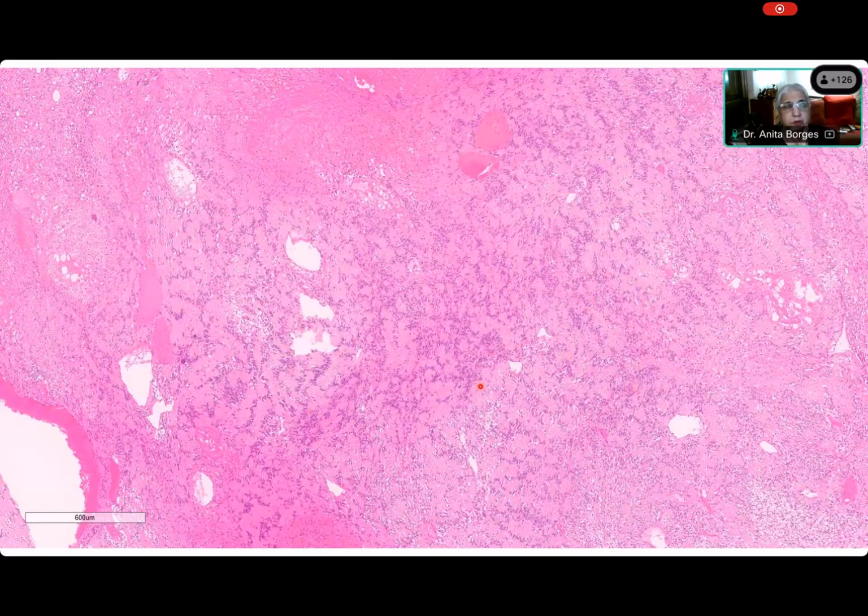Anyway, I know what you were showing me. I will do it. You are saying that these are hypocellular areas, right? All these? Yes? Is that what you're saying, Saida? Yes, ma'am. All these are hypocellular areas. Everybody agrees that these so-called hypocellular areas are Antoni B? No. So one of you tell Saida what is wrong. Yes, Deepali. Why are these not Antoni B areas? These are the Verocay bodies. These are Verocay bodies. Well, they are collagen, yeah.